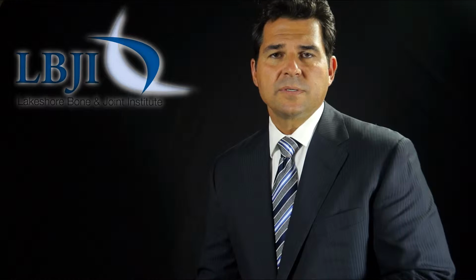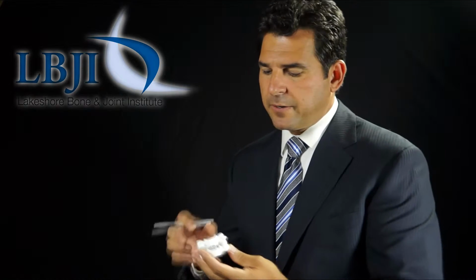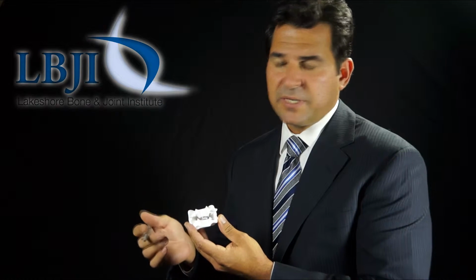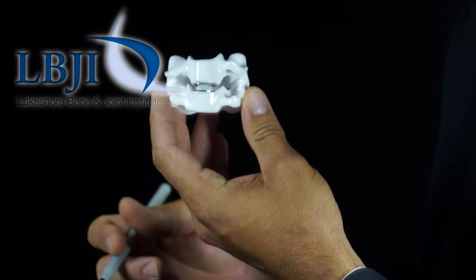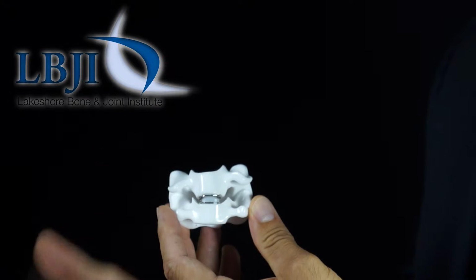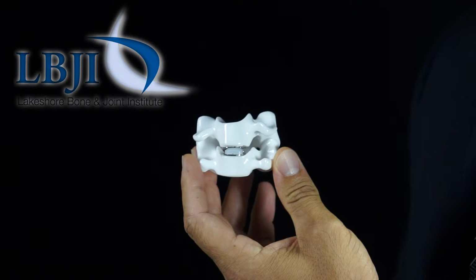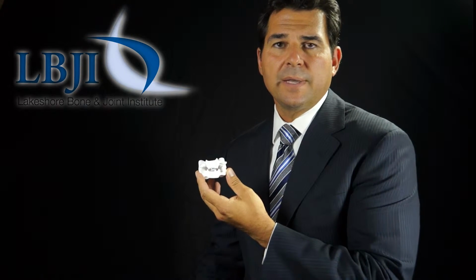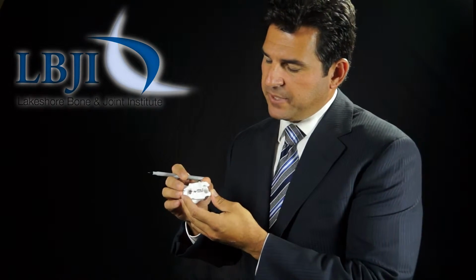The implant that I use is called the Mobi-C from LDR, and it is a mobile bearing device or an artificial disc replacement for the cervical spine that was approved by the FDA in 2013, and it's actually the only artificial disc that's approved for 1 and 2 levels. The remaining implants that are out and available on the market are only available and approved for 1 level implantation.